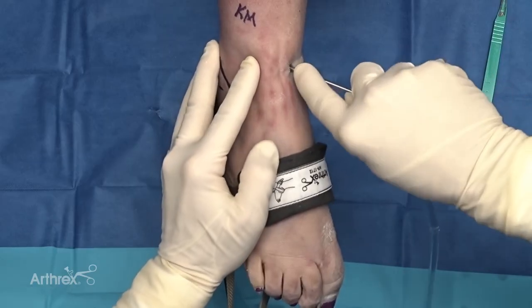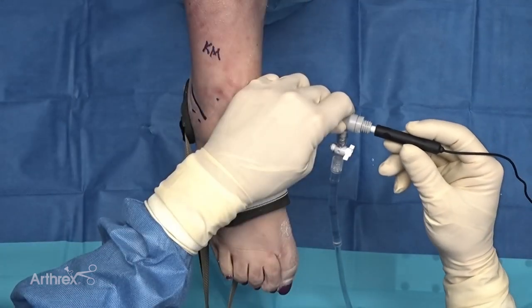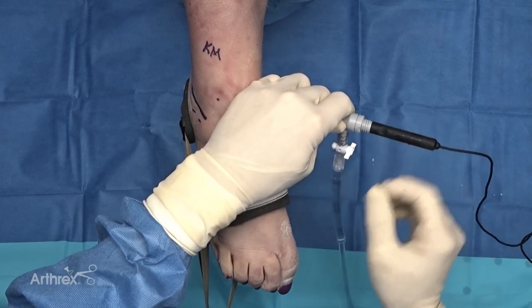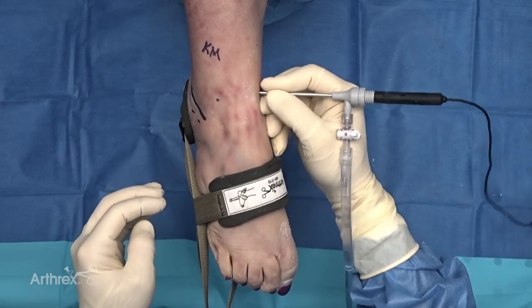With one simple stab, I hold my index finger and go right into the joint. The new nano needle comes in, snaps in with a small turn, and is now connected to avoid any unwanted pistoning. The camera can then be held like a pencil, allowing the surgeon ultimate control and the ability to look around the joint very smoothly.